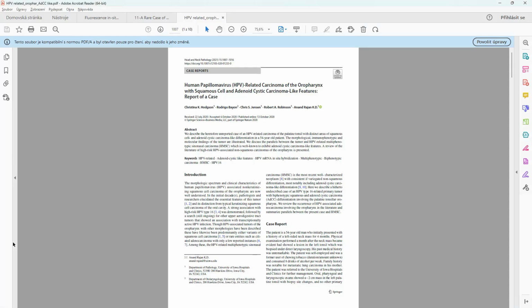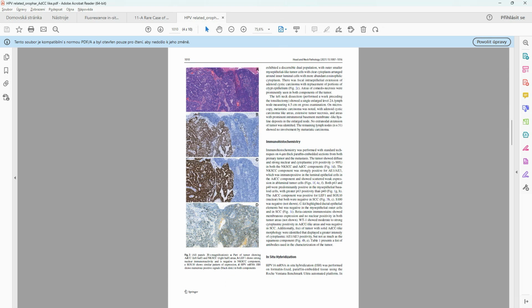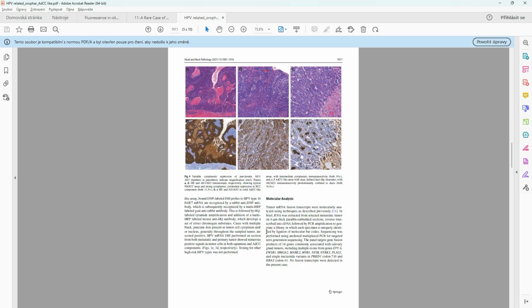And now please show me the paper. MYB is promiscuous. I do not like it. So this is the paper which I found, and I believe that it's a nice example. But now let me see what I should do. Now my mouse is not working. Yes, I'd like to show you the next page, how to do it. Yes, like this. Okay, so I think this is quite a similar case.